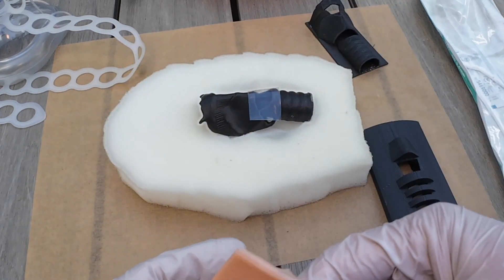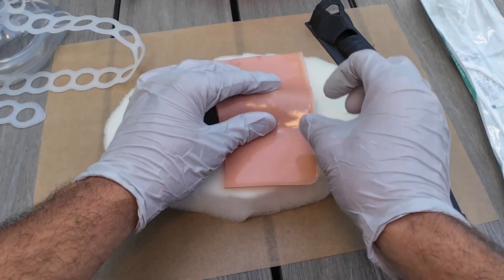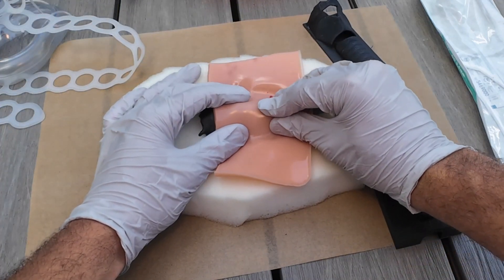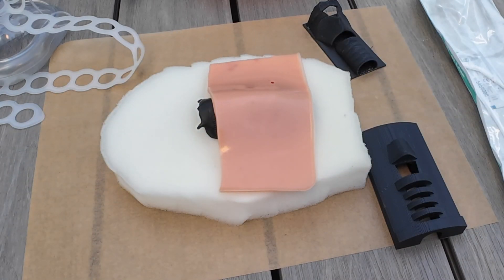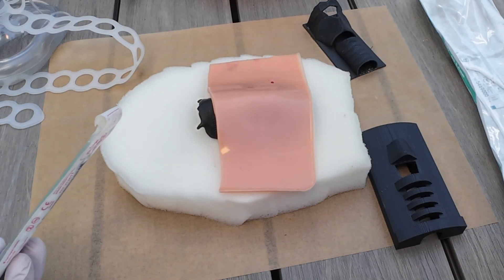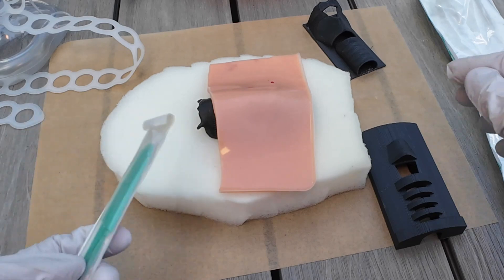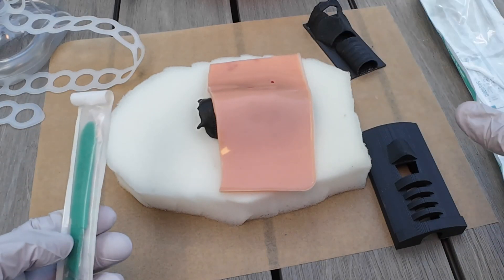Put that on top. Put the skin over top. And now you can actually practice that landmarking. Look what we have there. So we get our scalpel out. We have our bougie, our tube, just like we would be prepared. Plan C for us, put it on the patient's chest.